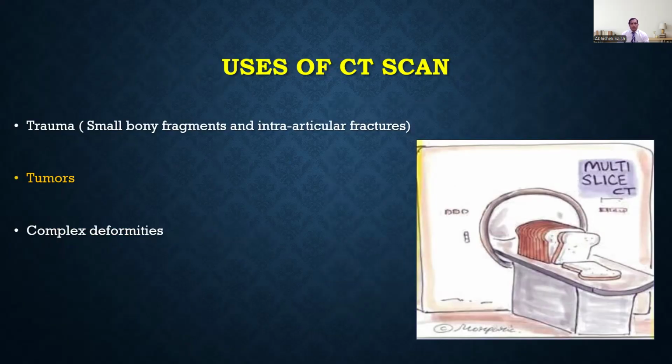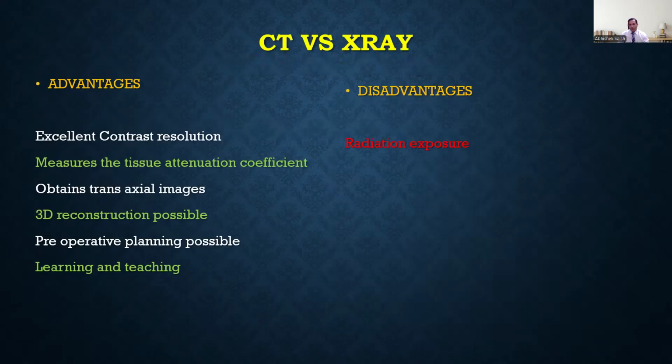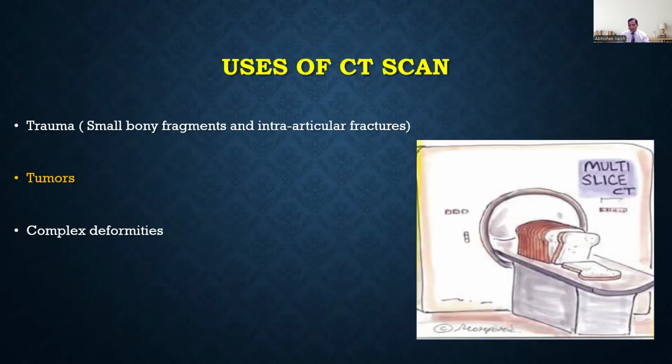So what are the uses? It is used in trauma, accident cases. Then it is also used in cases of tumors to find out what sort of a tumor it is, if there is calcification, and also in complex deformity cases.